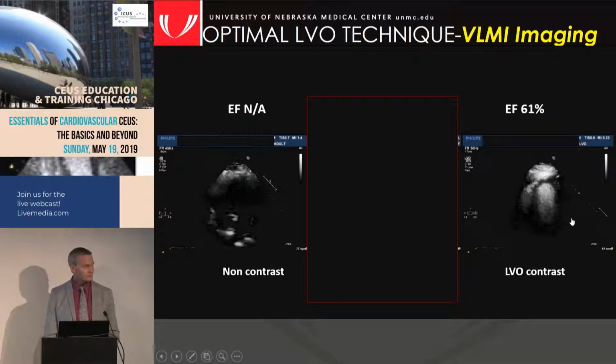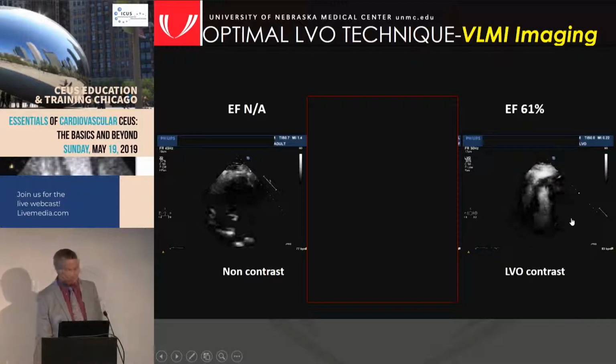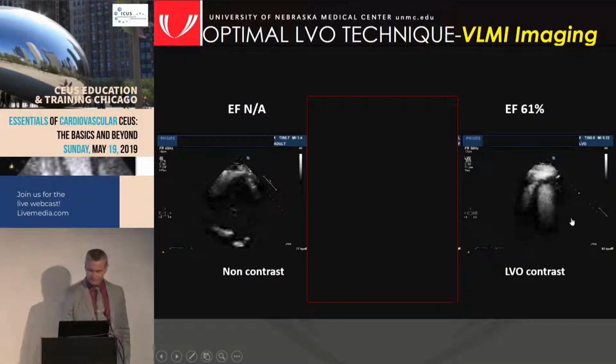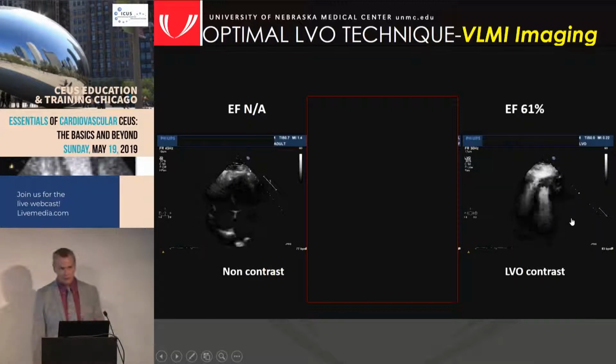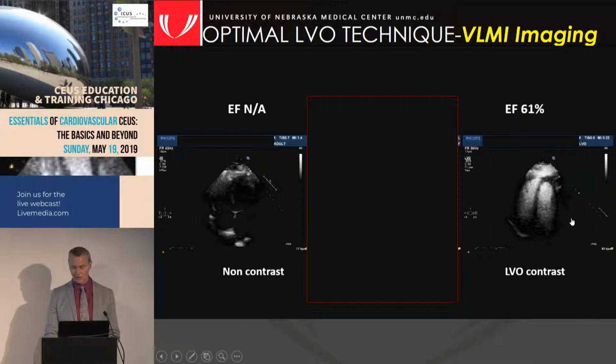Oh, Tom, can I just point out something too? Yes. This is 1.6 and 3.2. Right. So you're transmitting at 1.6 and you're receiving only at 3.2. As we said, that's pretty good. I just showed you that little signal. But we know one thing, that 3.2 megahertz in a 200-pound patient means a lot of this back here you're not getting much signal from because it attenuates.